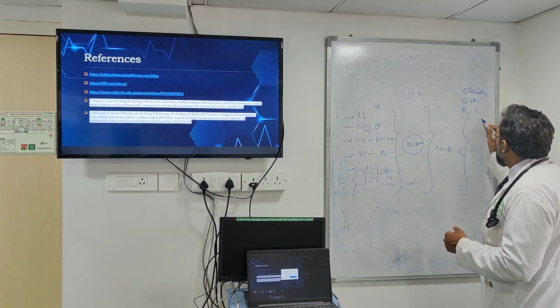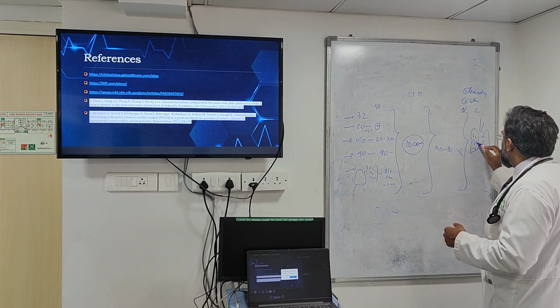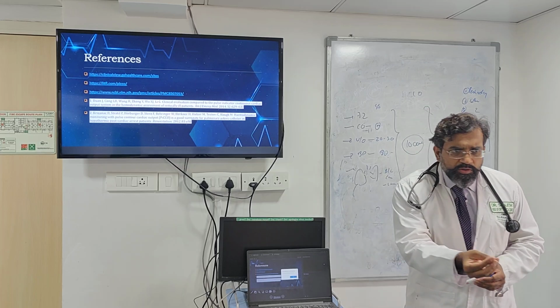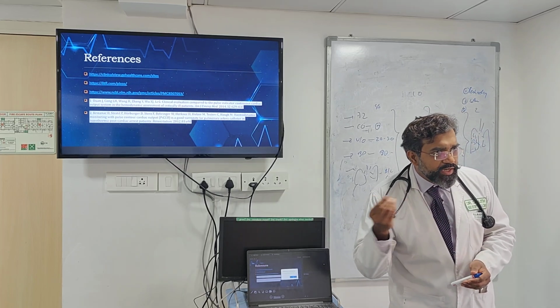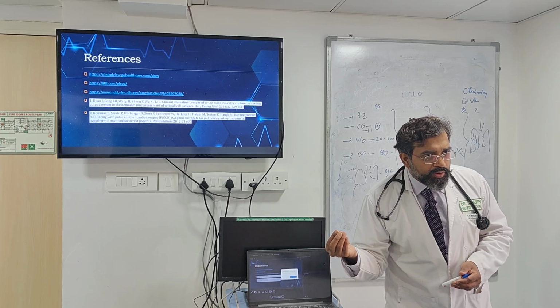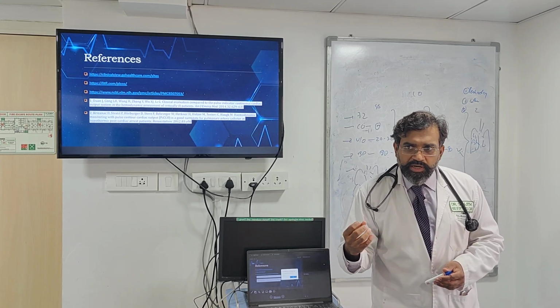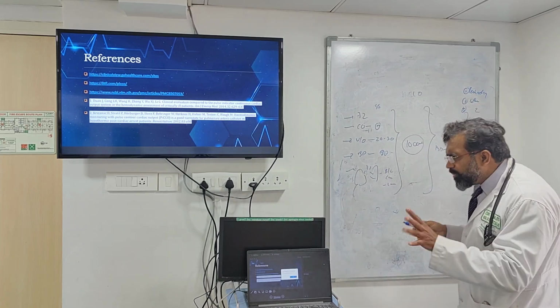You might find that two hours later, you repeat an ultrasound and you find bilateral more B lines have come. It has become B profiling. A small amount of fluid should not cause B profiling with a normal heart. So what is the entity here? Probably what is happening here is it is leaking. It is not hydrostatic. It is probably going to be leaky.